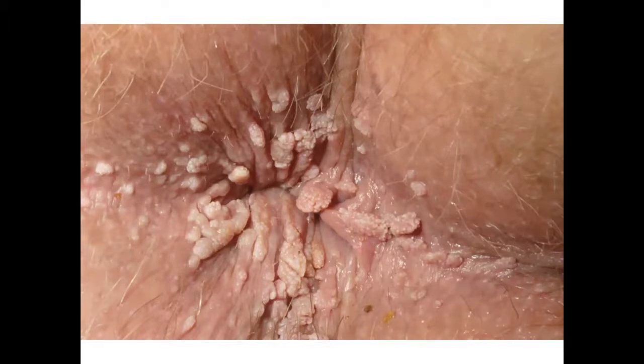The other thing I usually do, for both urethroscopy and anoscopy, is wait until you've cleared all the external ones so you're not seeding internally. Right. So again, the diagnosis is not hard, but the mechanics of treatment take a little bit of knowledge. And then more typical condyloma, to contrast with the higher risk type that in comparison tend to be more sessile, more pigmented.